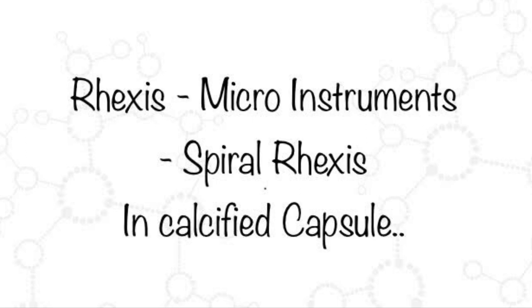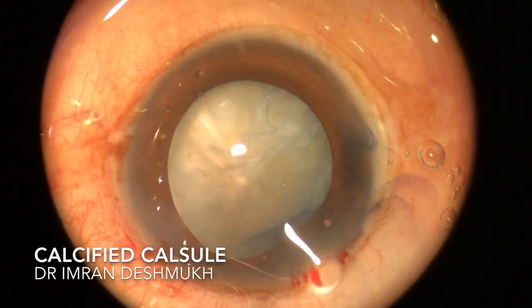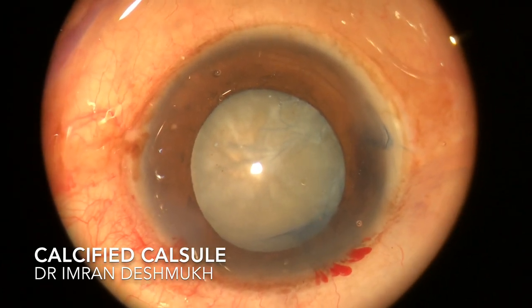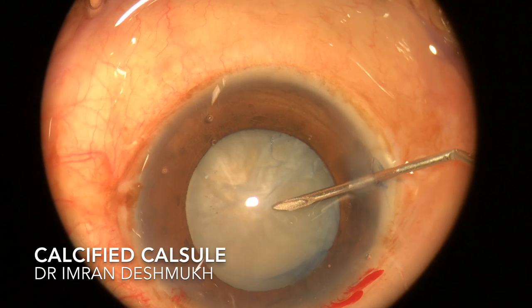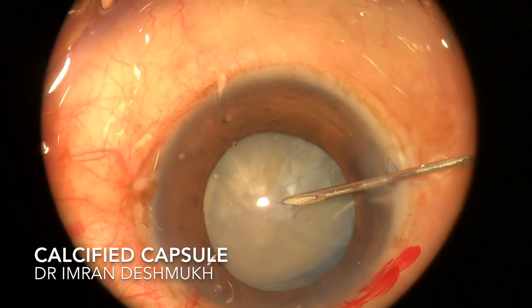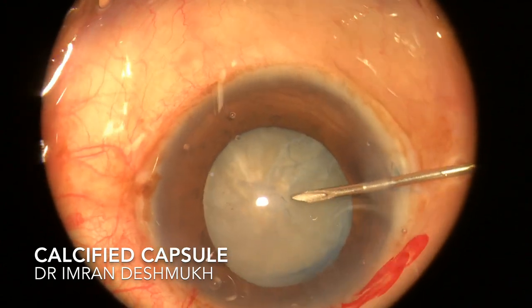Hello friends, today we'll be discussing how to make a rhexis in a case where you have a calcified capsule. After staining the capsule with blue dye, you can see there are folds on the anterior capsule. Once I entered my cystitome to the side port, I tried to make a nick, but it was very hard. You can see the anterior calcified capsule — you don't want to stretch too much as that might cause zonular weakness.